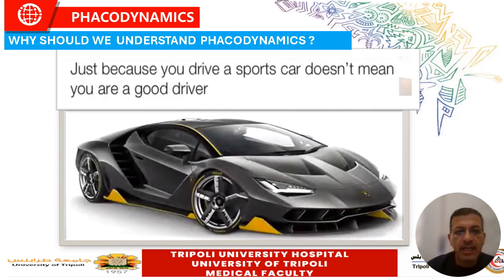By understanding the principles behind the phacodynamics, you can adjust and modulate your parameters according to the patient, according to the type of cataract, and according to different scenarios that might happen during your cataract surgery. Just because you are driving a sports car doesn't mean that you are a good driver. The good driver understands the machine that he's using, and he can handle any abnormal scenarios that he is not expecting, and end up with a safe surgery and satisfied patients.